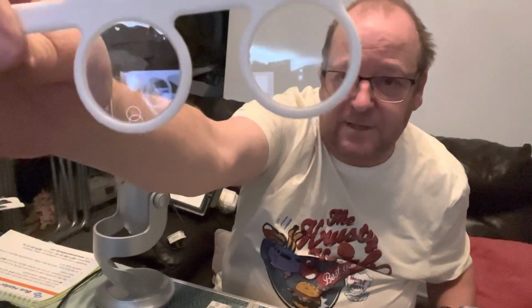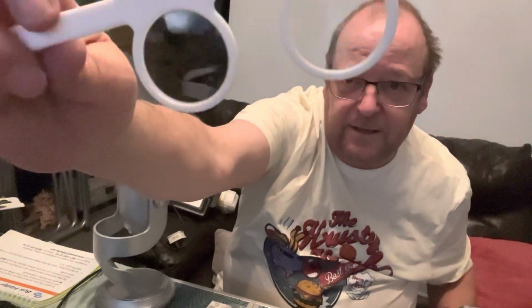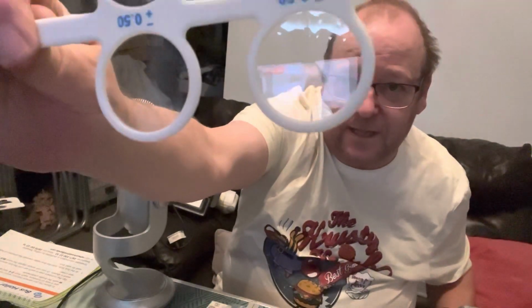Next I have something with a very simple name: paddles. I've got three different paddles. The first one is a plus and minus 0.50. As it stands now, as I put that in front, that magnifies, and if I turn it over, that minifies. This is very good when checking the vision with somebody who's got their glasses on, to see if it can be improved.